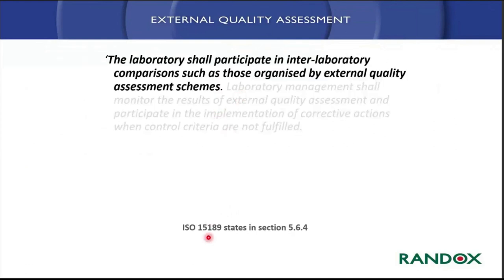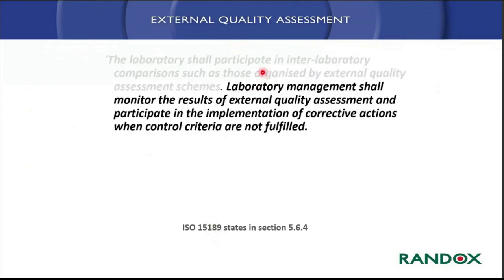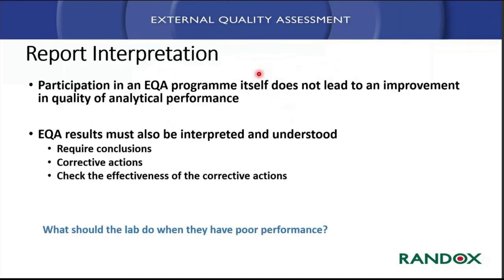In the 15189 standard, once again, it mentions participating, but it also mentions monitoring your results and implementing your corrective actions when the control criteria are not fulfilled. So it's more than just participating, it's actually implementing your corrective actions. Running a scheme in itself doesn't lead to an improvement. You have to be able to interpret and understand your reports. It requires conclusions to come to corrective actions and to be able to put effective corrective actions into place.